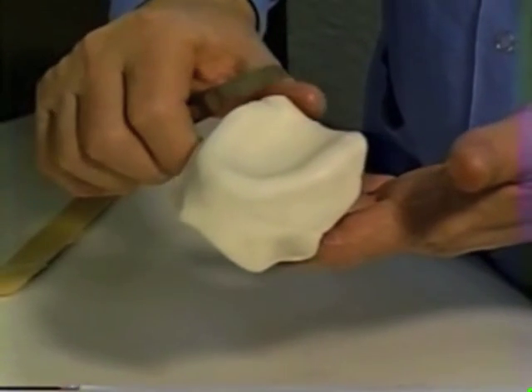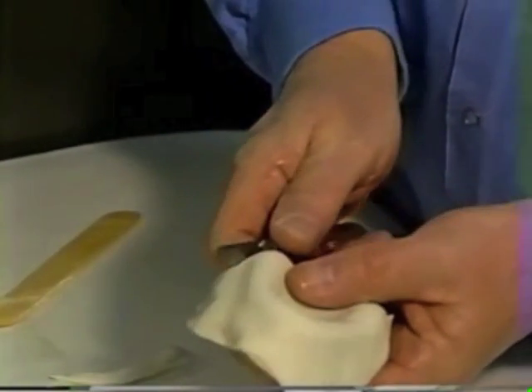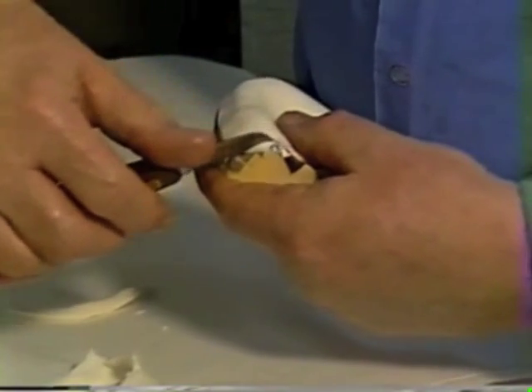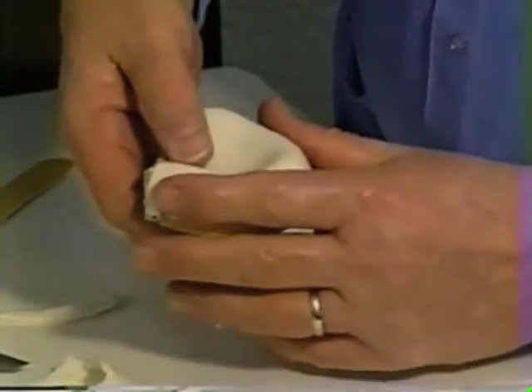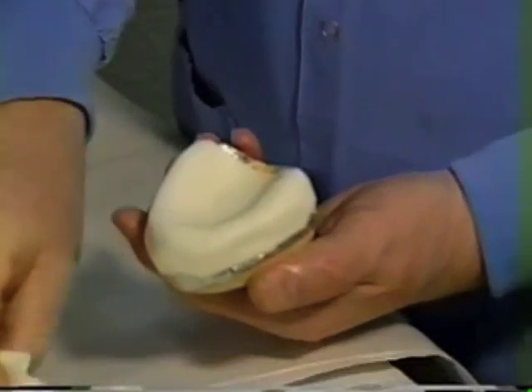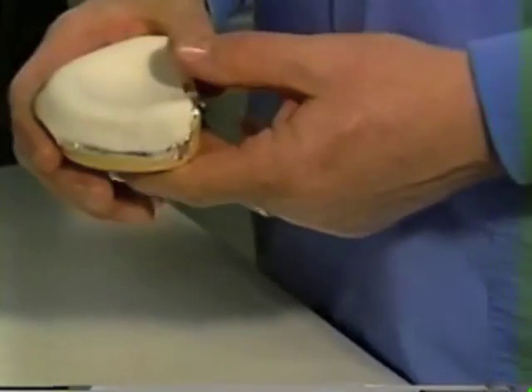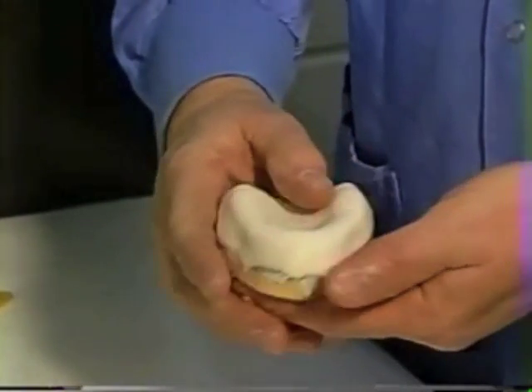Cut the excess material off, purposely leaving it a little long because we're going to be trimming it with a burr and a rotary instrument after it's set and after we get a handle on it. The material should be nice and smooth without wrinkles, and it doesn't need polishing if you do it this way. Notice we did not add extra monomer to smooth it out — all that does is ruin the properties of your tray and develop an allergy. Do not pour extra monomer on it to smooth it out.